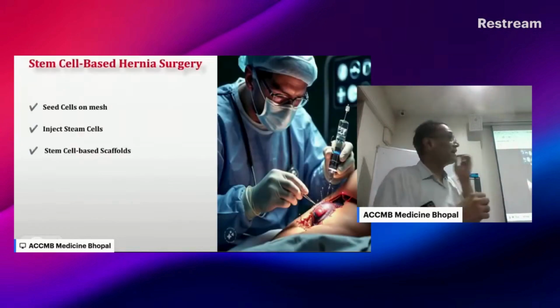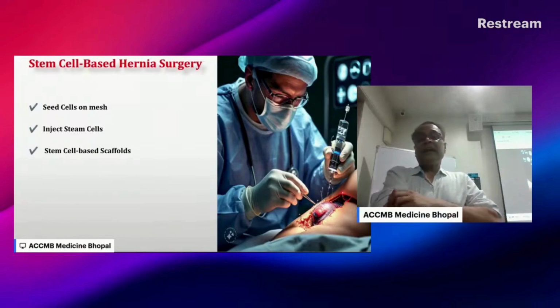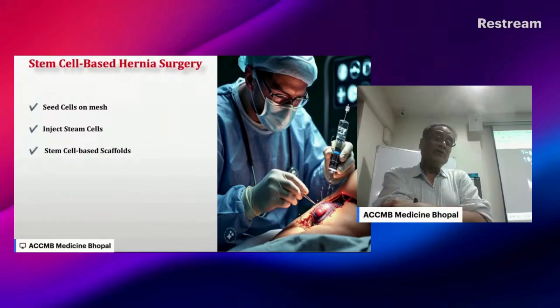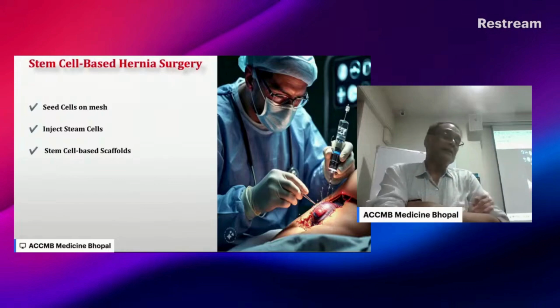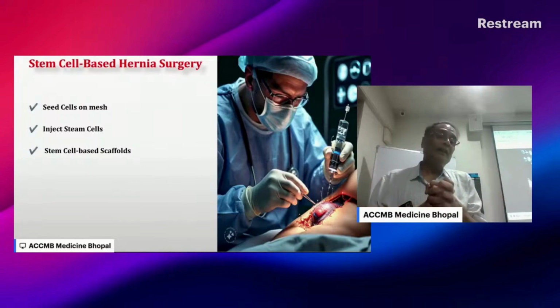Now, stem cell based hernia surgery. In stem cell based surgery, the stem cells are taken out, and in the form of seed cells, they are sprayed over the meshes, in the form of injections, in the form of scaffolds. At present I have not seen stem cell based hernia meshes, but soon it is going to be available in our medical field, and I hope that this mesh is going to be very effective for hernia surgery.